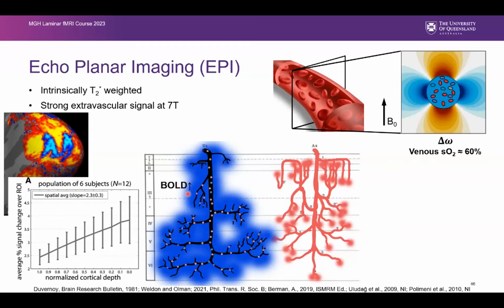But it is quite a strong contrast. It's very sensitive, very robust, and very easy to use. And we have seen that even David Norris, as a proponent of spin echo, finds many useful ways to use it. Yeah, I think it's a good starting point.